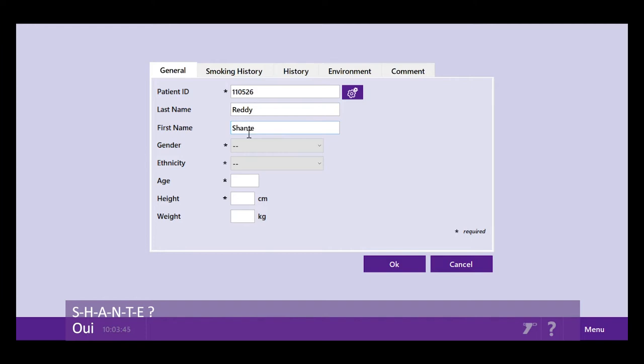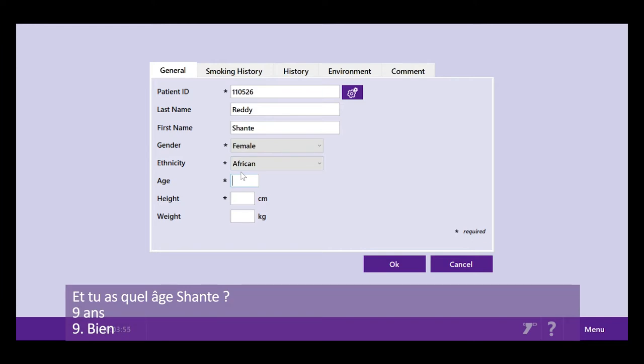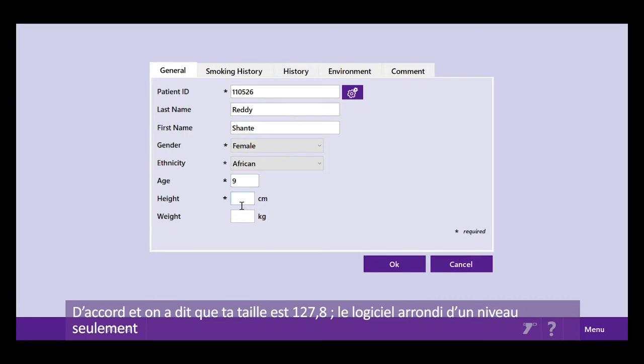S-H-A-N-T-E? Yes. Okay. Female? Ethnicity? African? Okay. And how old are you, Shanti? 9 years old. 9. Good. All right. And we said your height is 127.8. This software only takes it to the next level, and this was 24.6. So let's make that 25.